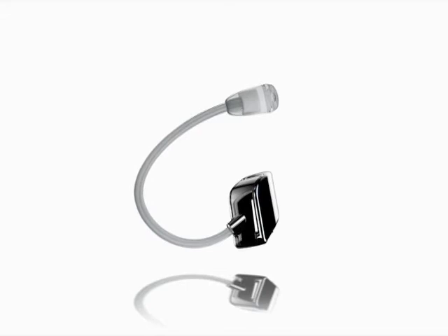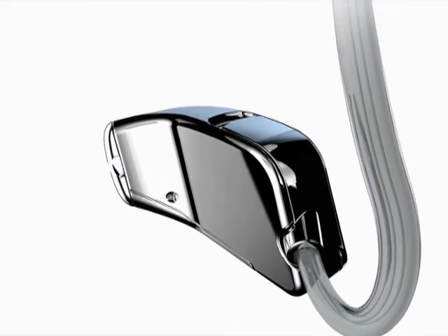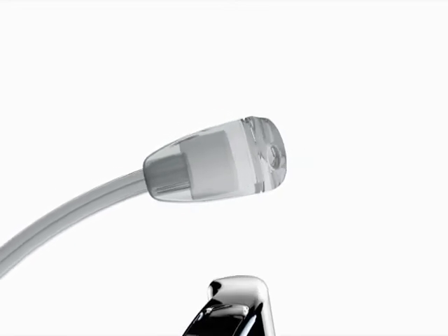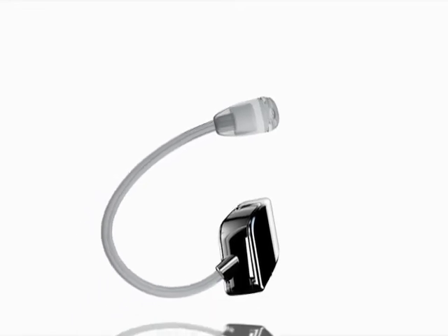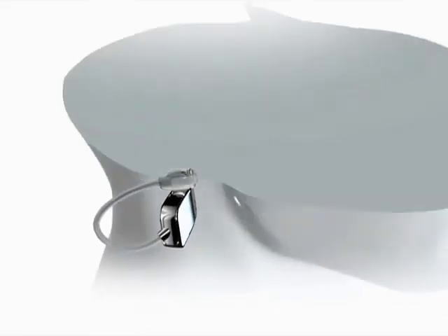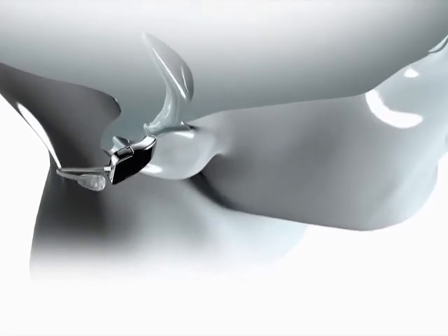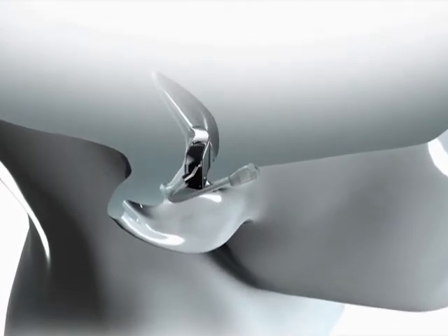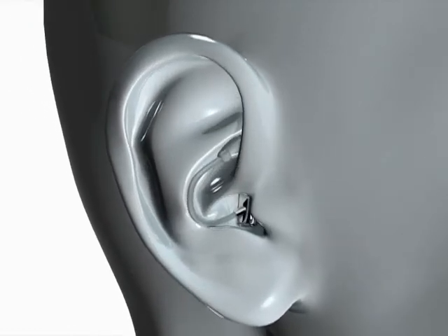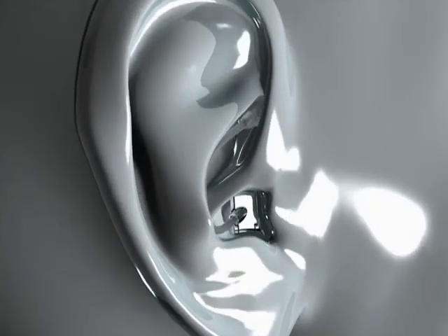Now we're going to take a close look at the body of the instrument. This will fit into the ear canal. Attached to the body is a microphone tube, and at the very end you have your microphone, which tucks into the helix. The body of the instrument inserts into the ear canal much like a CIC. The microphone is then curled up through the concha and tucked into the helix. This placement is especially good for reducing wind noise.